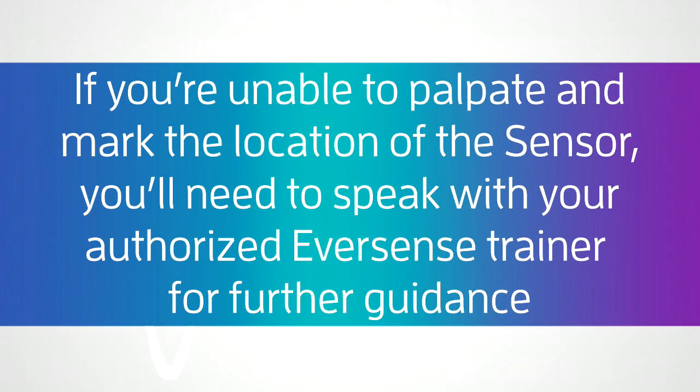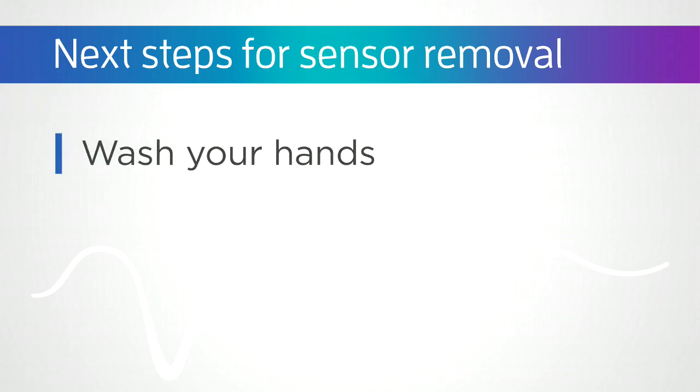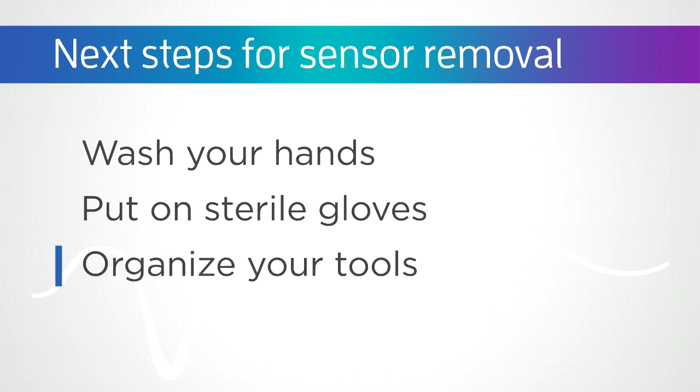If, however, you're unable to palpate and mark the location of the sensor, you'll need to speak with your authorized Eversense trainer for further guidance. Once you've marked the planned incision line for the sensor removal, follow these next steps. Wash your hands. Put on sterile gloves. Organize your tools and place them in order of use.